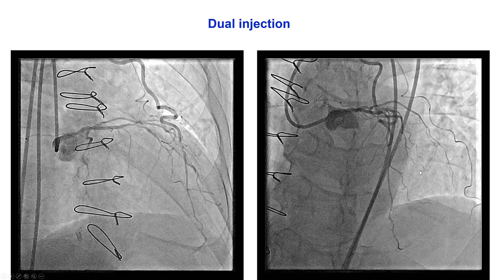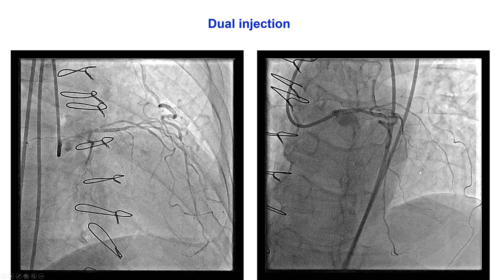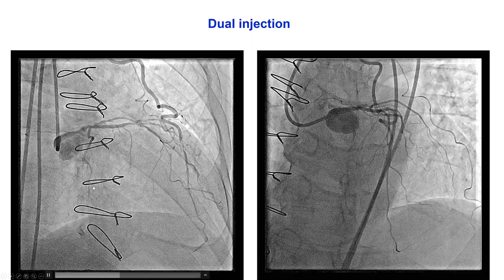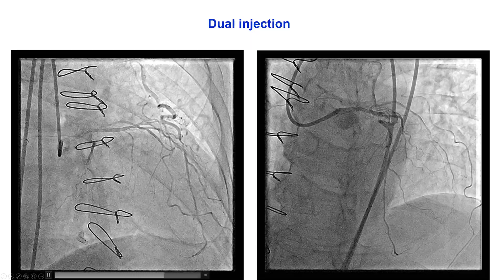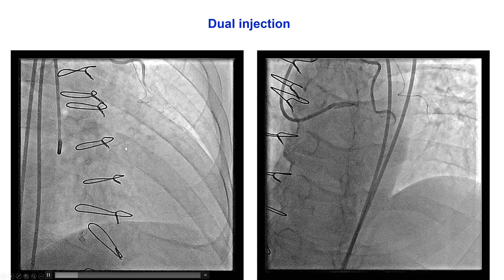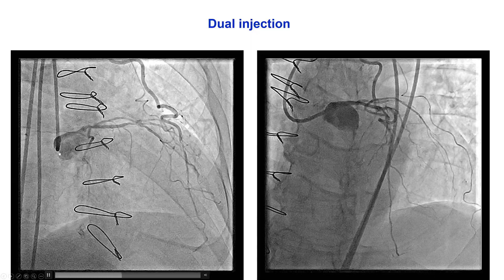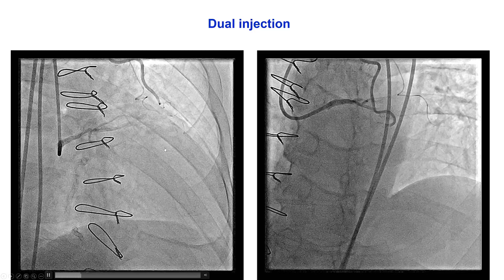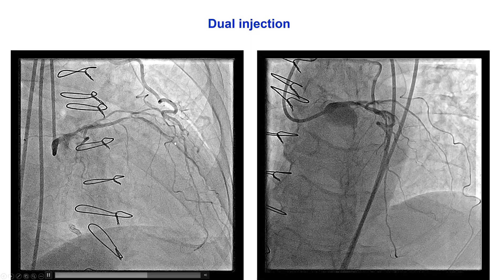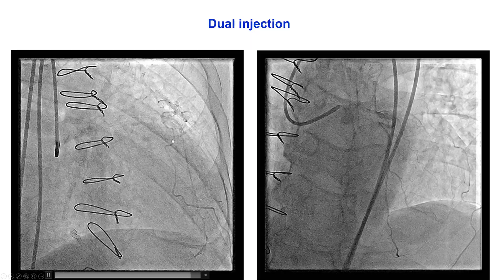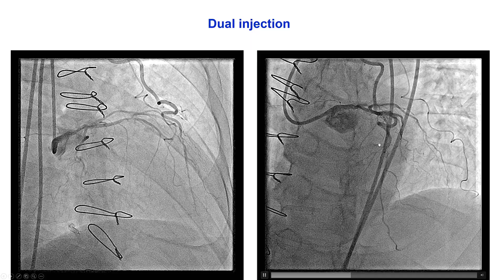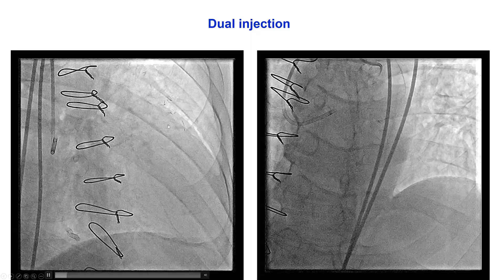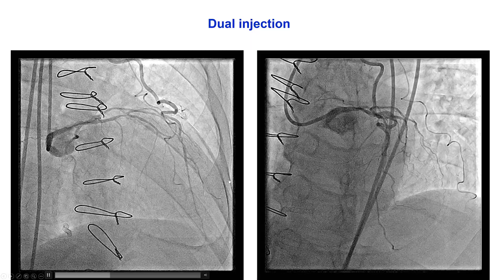We started with a bifemoral approach. We knew this was going to be a challenging lesion to treat, whether we treated the LIMA anastomotic lesion or the native CTO. We engaged the IMA with a 7 French IMA guide and the left main with an EBU 3.75 guide. On dual injection, we can see tenting of the vessel, which makes it quite challenging to understand the course of the vessel. This is common with bypass grafts — they tent the native vessels and can make it difficult to recanalize the native coronaries.